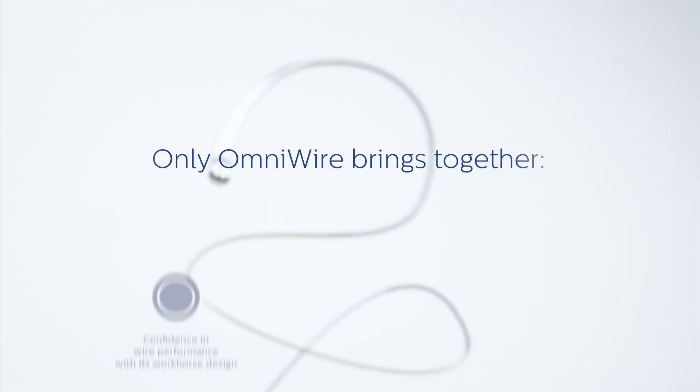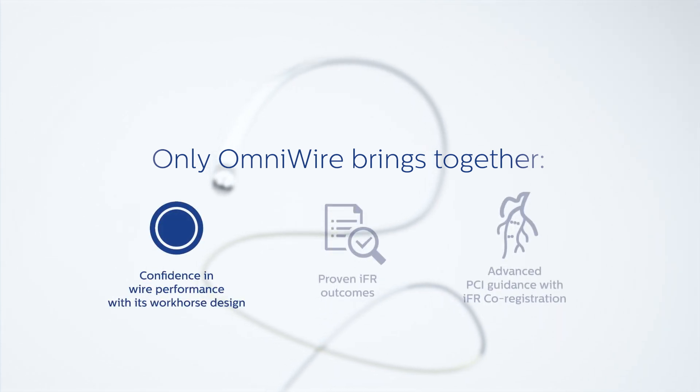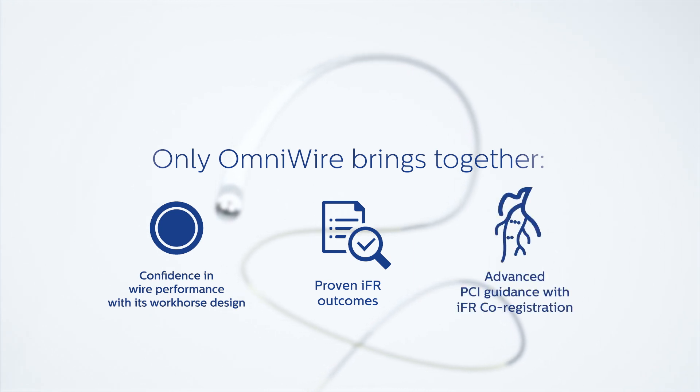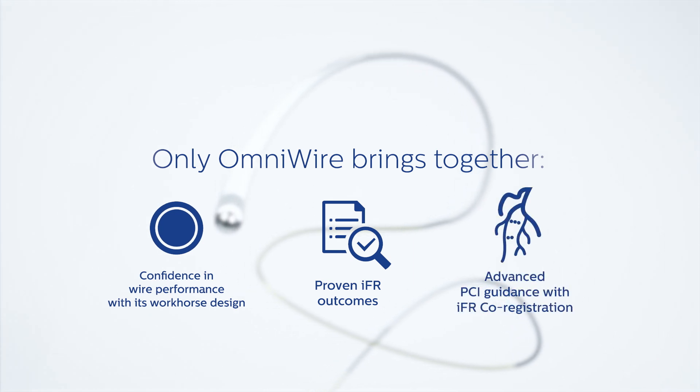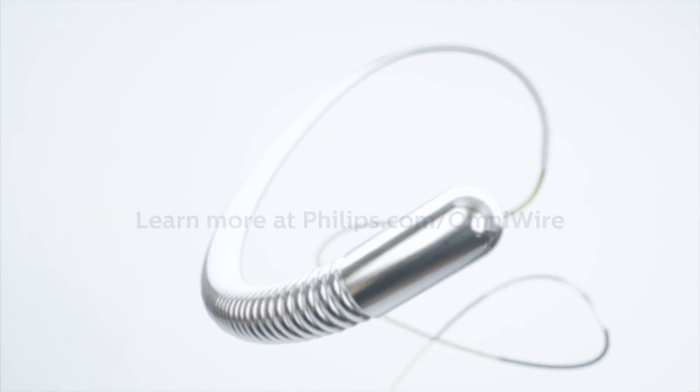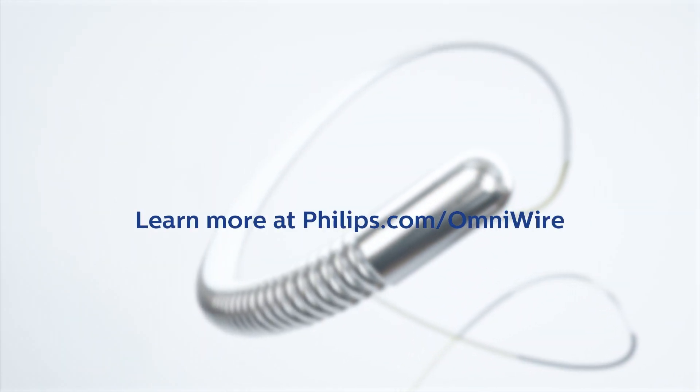Only OmniWire brings together confidence in wire performance with its workhorse design, proven IFR outcomes, and the advanced PCI guidance of IFR co-registration. Introducing OmniWire — solid core, no compromise. Learn more at philips.com/OmniWire.